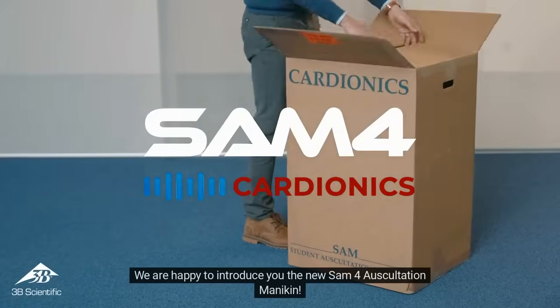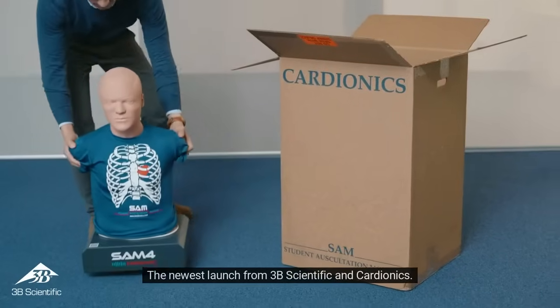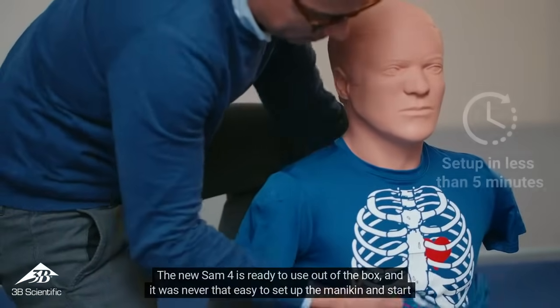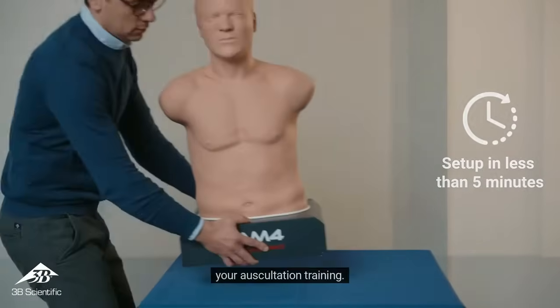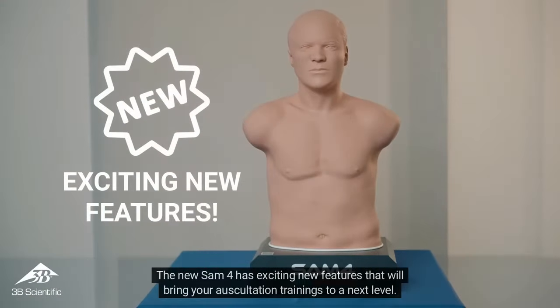We are happy to introduce the new SAM-4 Auscultation Mannequin, the newest launch from 3B Scientific and Cardionics. The new SAM-4 is ready to use out of the box, and it was never that easy to set up the mannequin and start your auscultation training. The new SAM-4 has exciting new features that will bring your auscultation training to the next level.